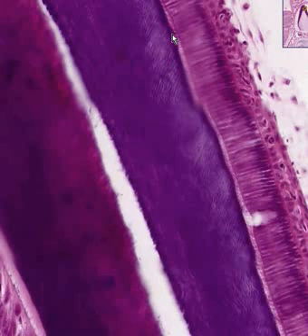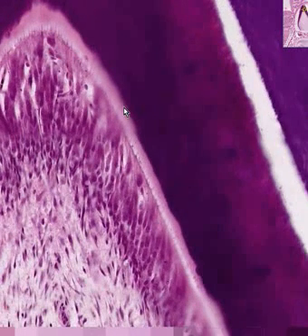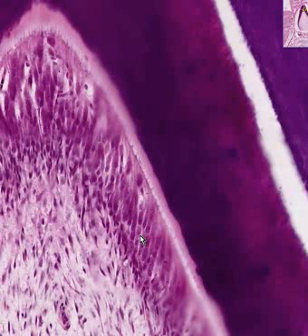I want to show you that in the enamel, we could see lines extending into it, which are the Tomes fibers. And in the dentin, we could see lines extending into it between the odontoblasts and the dentin, which are called dentinal tubules. So let's run this down real quick. Odontoblasts on the inside, showing little fibers extending to the dentin.